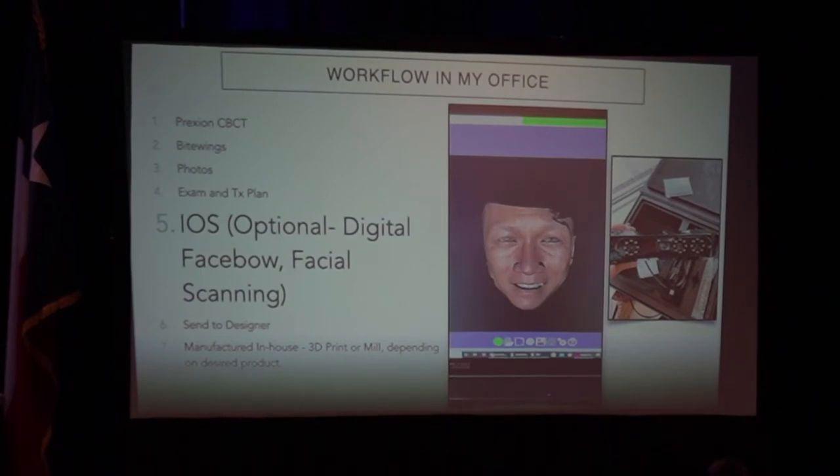So what a 3D face scanner would do, we're going to be able to manipulate it and not distort the photos. A 2D photo, what I mean is, if you have good photos, that would be key. You can save a lot of money and a lot of time, because honestly, I don't use this much unless somebody's really canted and I don't want the designer to think that something is off, because we're going to show that we overlay the photos with the intraoral scanner.